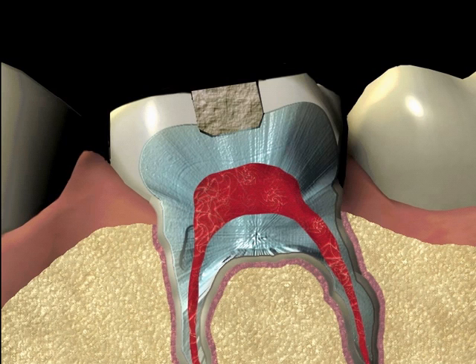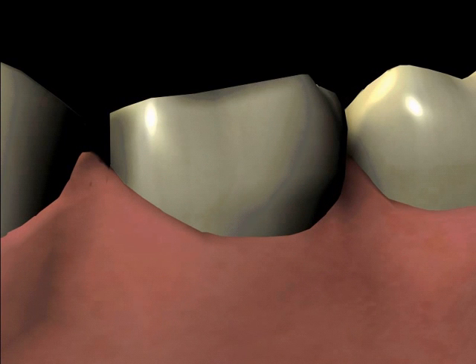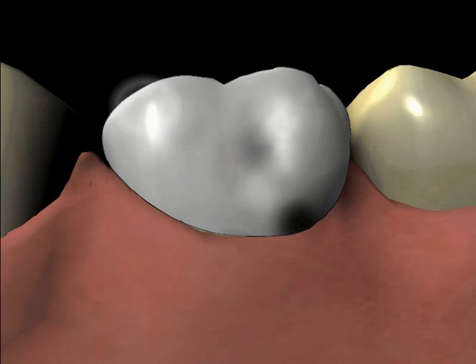An impression or mold is taken of the tooth so that the crown can be fabricated. A temporary crown is then made to protect the tooth and assure the tooth is comfortable while the crown is being created.